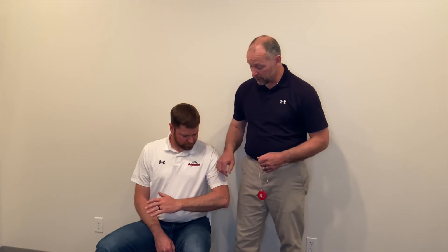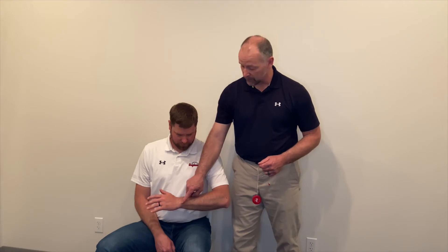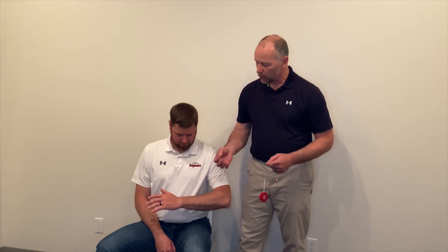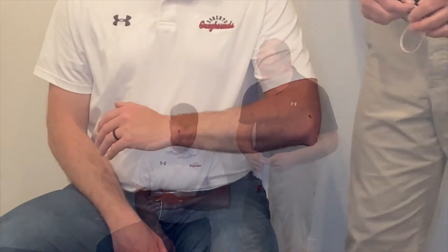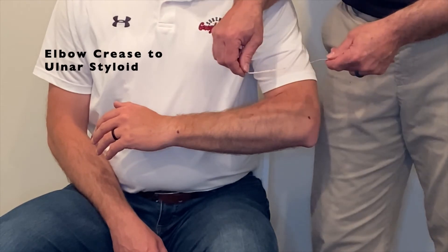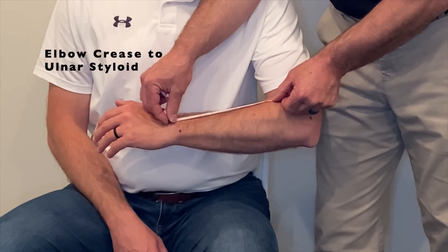Now we're going to move on to the forearm measurements. The first measurement we're going to capture will be from the elbow crease down to the apex of the ulnar styloid. You can see we've marked both the ulnar styloid and the lateral epicondyle. If you have a patient where these bony landmarks aren't particularly prominent or are difficult to palpate, we recommend you locate and mark those first so you can find your endpoints easily when measuring. Our first forearm measurement from the elbow crease to the apex of the ulnar styloid is seven and three quarter inches.